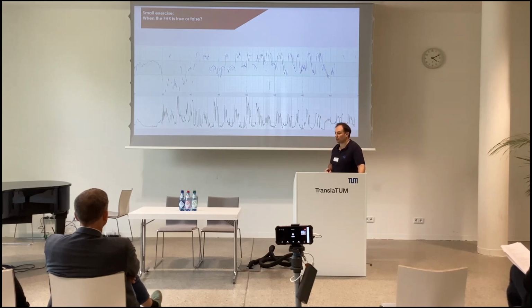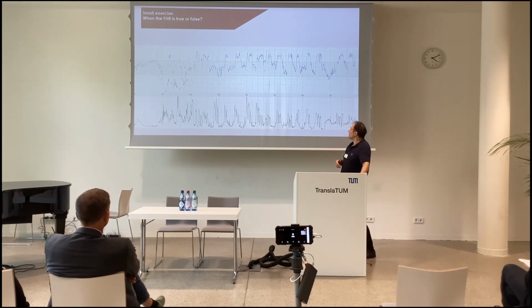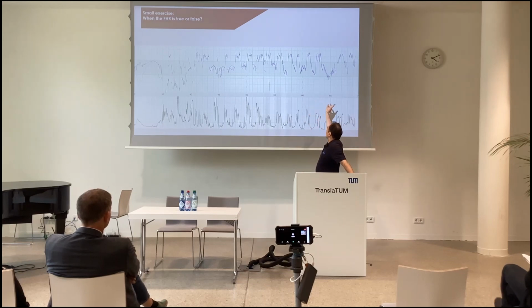This is what we have on the paper and on the Philips. We don't have that. So I think it's good to not have that, because really it's complicated to see the match without. So when you have a very good solution, there is indeed mostly maternal heart rate, and there are some parts of fetal one, and we see that the correspondence is not exact. So we can say that it is most likely true FHR.